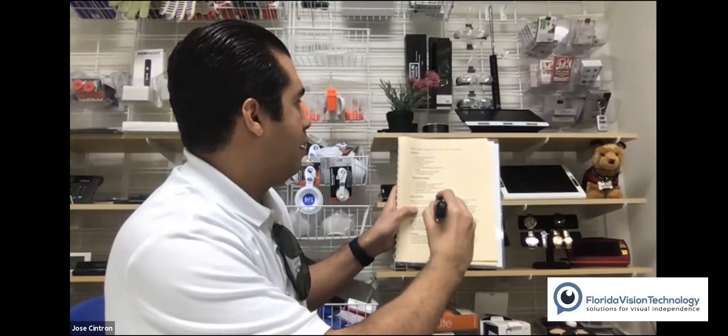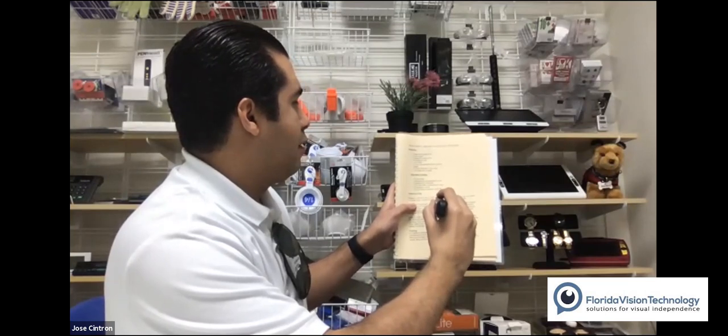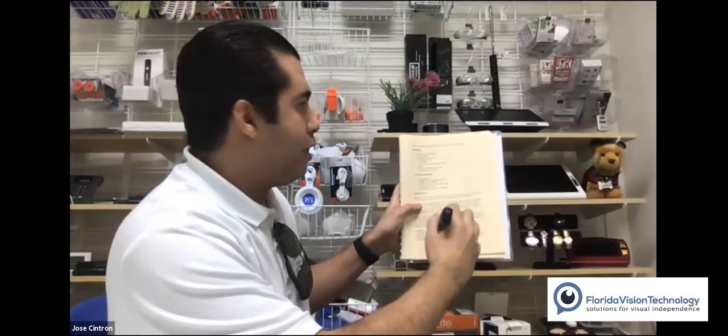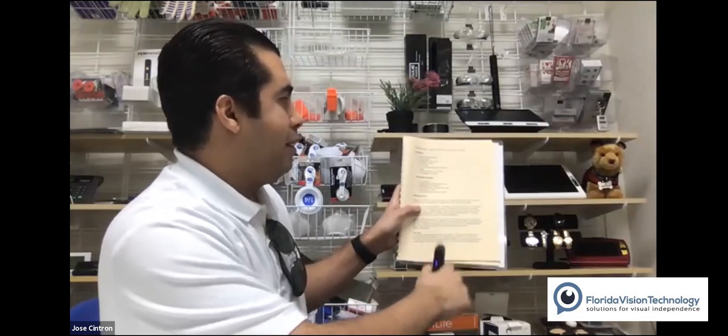Saucepan, combine 1 cup butter, right? So it's not reading from the top of the list or the top of the page. It's reading from down in this area, right? Again, I can press that minus key to go backwards.